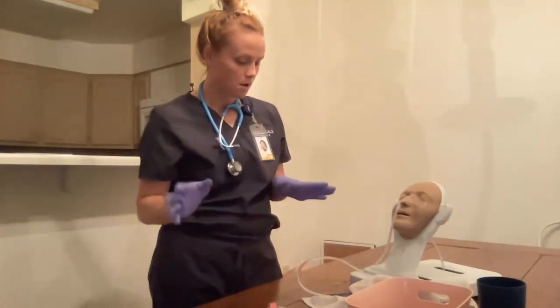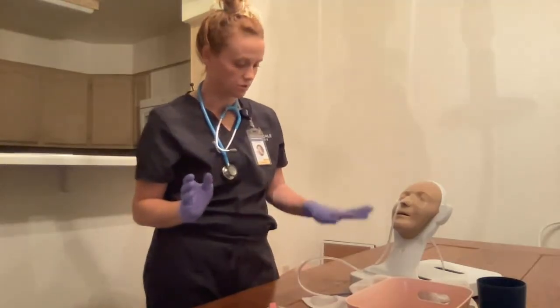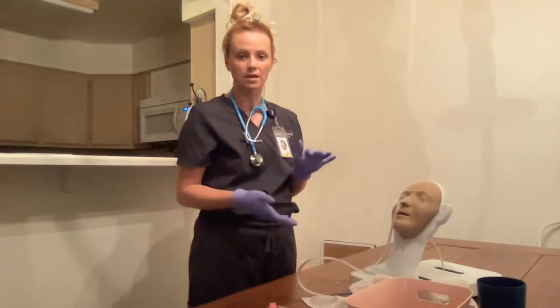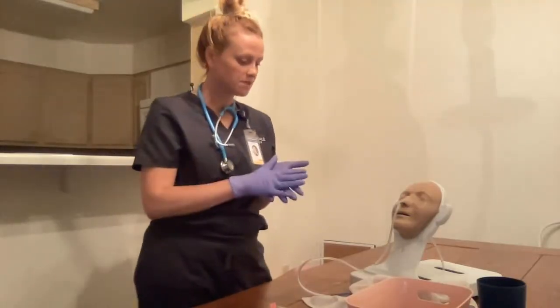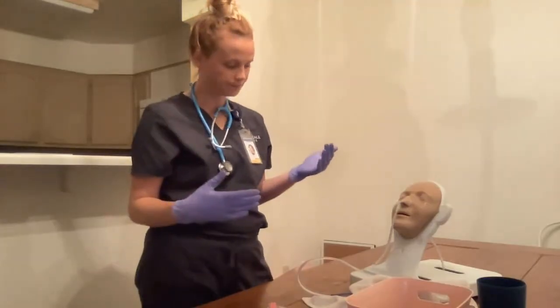All right. Also, regarding plan of care for the NG tube, I would want to maintain patency for any lining, whether it be for the NG tube or the suction lining. I want to note characteristics of any drainage, the amount of drainage, and be sure to document that regularly.